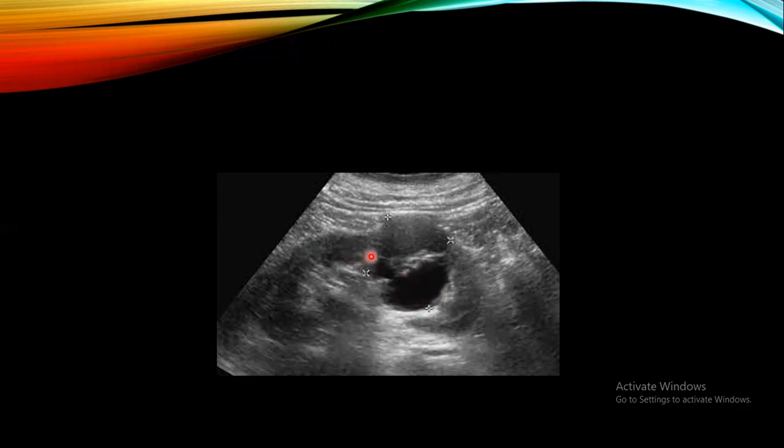For this type of cyst, when we see the mass bulging from the outer contour of the kidney, and here is the mass, we consider this a Bosniak 4 cyst. If the mass exists, we consider it Bosniak 4, and we shall go immediately for radical nephrectomy. And with this Bosniak 4, there is no way for waiting, there is no way for aspiration. Send the patient immediately for MRI and CT scan and take your decision for radical surgery for the cyst.